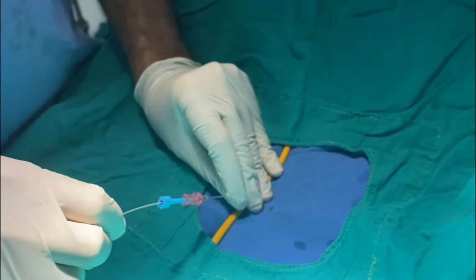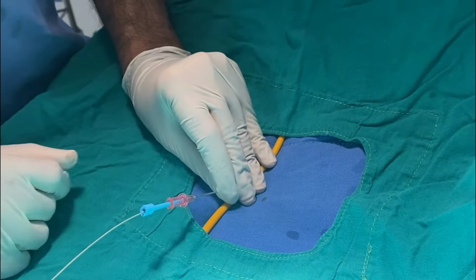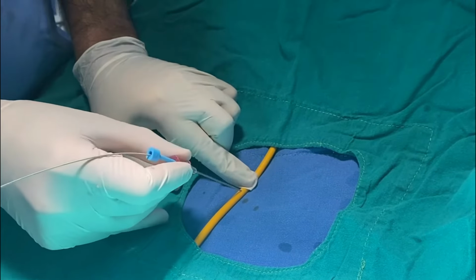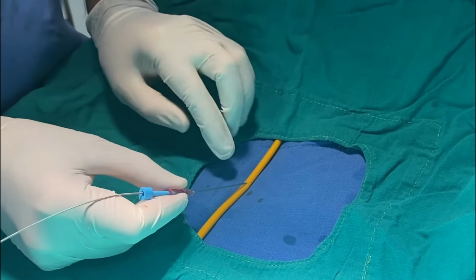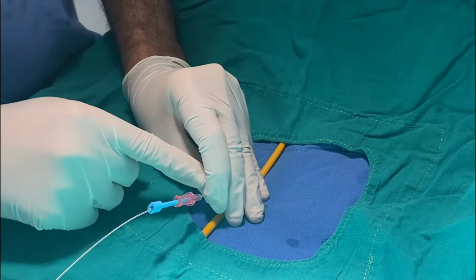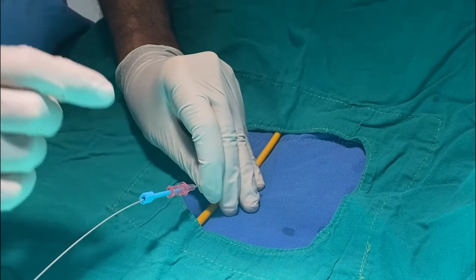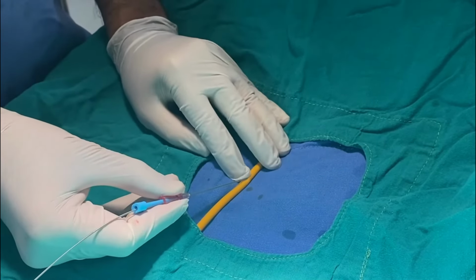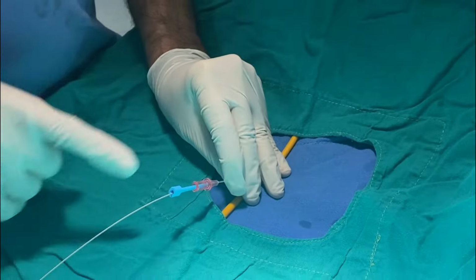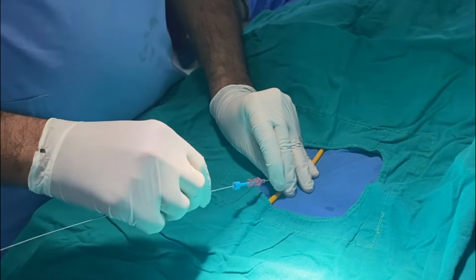Once it goes inside, lower the puncture needle a little bit from the 45 degrees so that it will be in line with the artery. So you puncture at 45 degrees, and the moment you start pushing in the J-tip wire, you lower it a bit. Always stabilize the needle with these two fingers, the thumb and the forefinger, so that the needle does not move, because it is just entering. If you are not careful, it will come out or counter puncture. Once you are clear like this, you push like this. The moment it comes out, it will go in easily. See, it will go in easily.